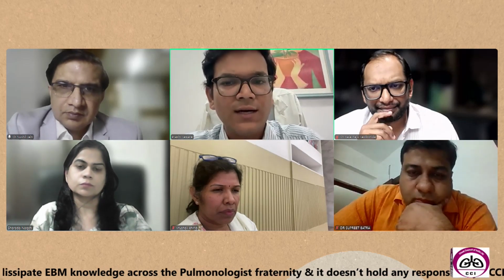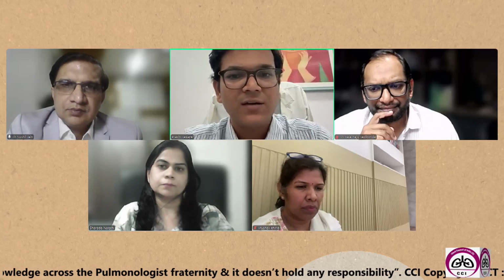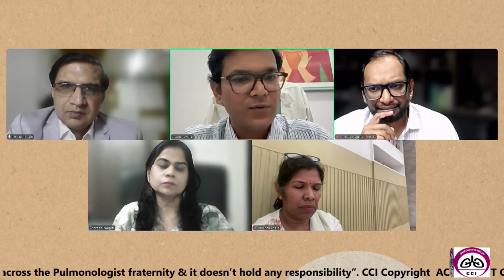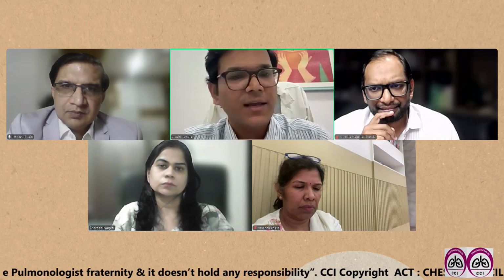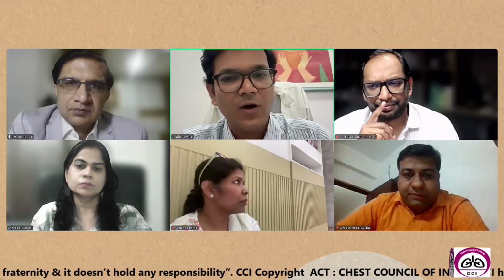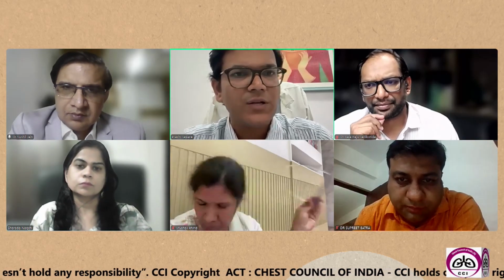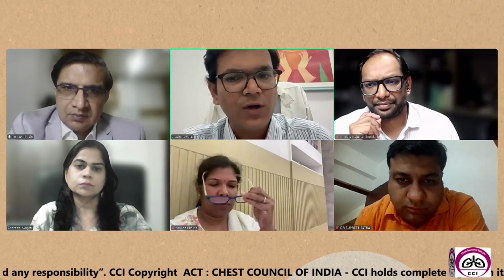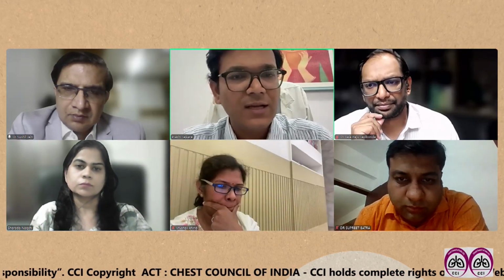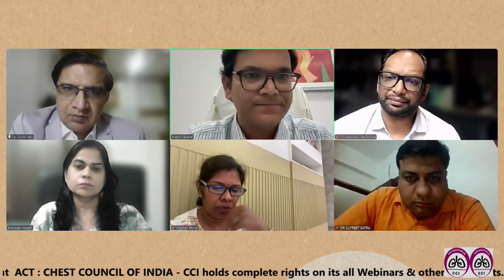Again, what we need to understand is there is no single specific mediastinal lymph node characteristic that can distinguish between benign or malignant cells. So based on pretest probability and a combination of sonographic lymph node features, you can get help. It can help in giving a differential diagnosis, but obviously not replace the biopsy.